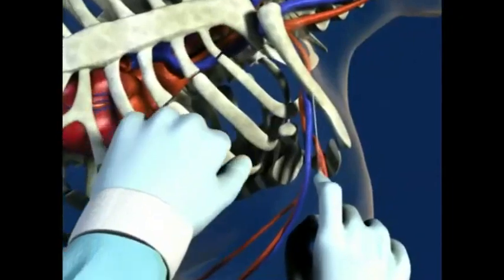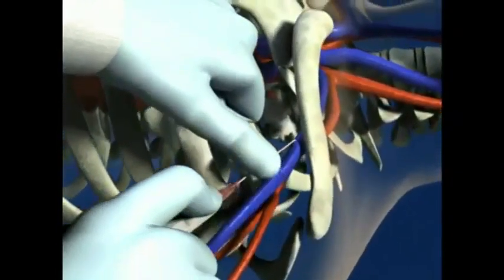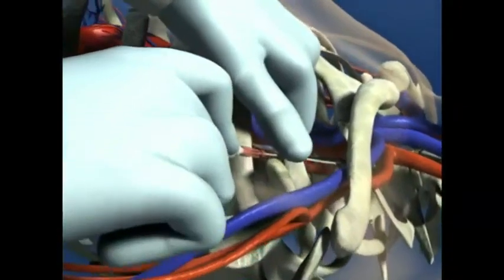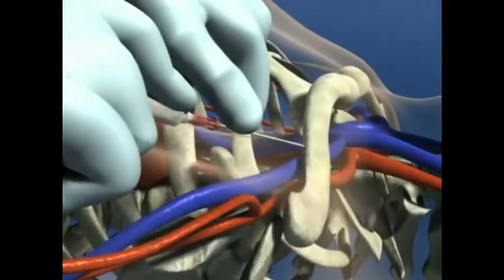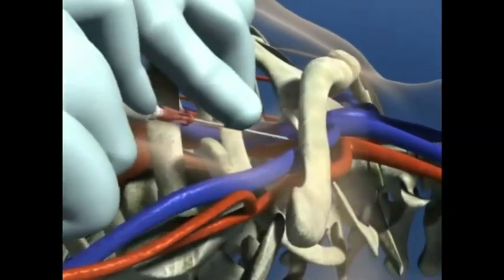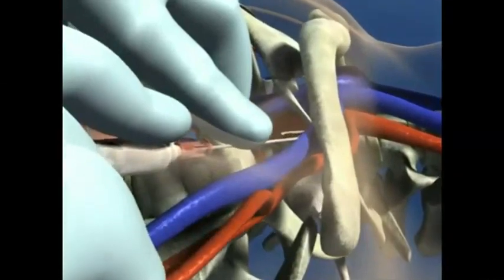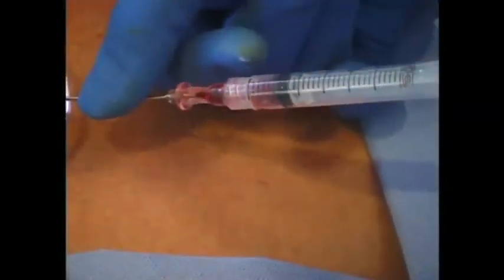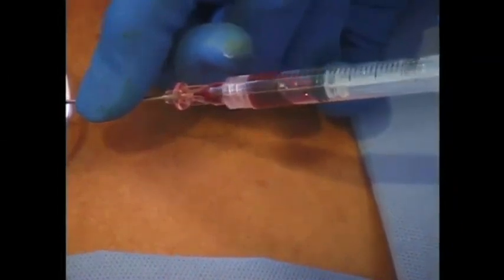Instead, the needle is inserted and aimed at the clavicle, but the thumb of the opposite hand is used to depress the needle down while maintaining a horizontal orientation. The needle is advanced until the clavicle has been encountered. After gently touching the clavicle, the needle is pulled back and further downward pressure is applied as the needle is advanced just below the clavicle. While this is being done, constant negative pressure is maintained in the syringe, and a flash of blood in the syringe indicates the vein has been entered.